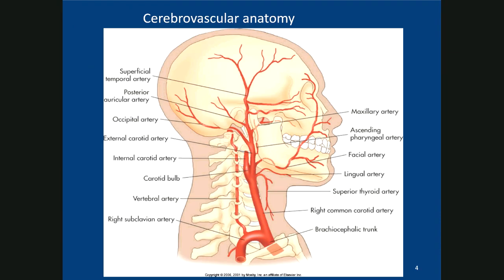And this is a picture showing you the right side, so you can see, I think I have the pointer on, this is the main right carotid artery. This is the internal, and this is the external. And this is what we were practicing last week. Some of the clues to help you understand whether you're on the internal or the external when you're scanning are listed in this PowerPoint, but I'm going to show you visually how the external is closer to the actual face and the internal lies more posterior to the external.